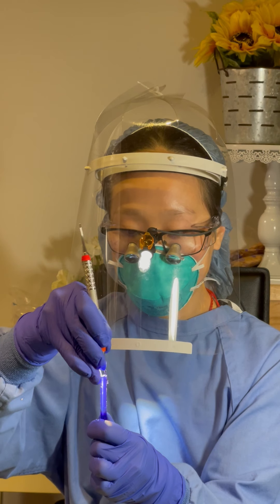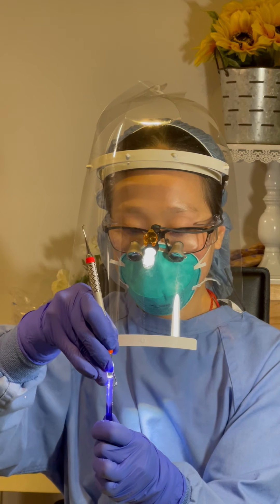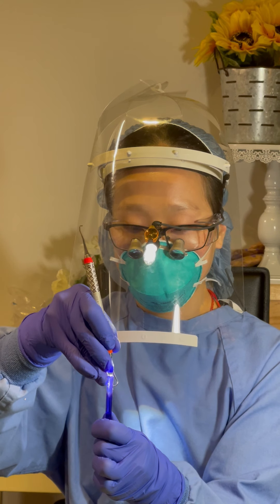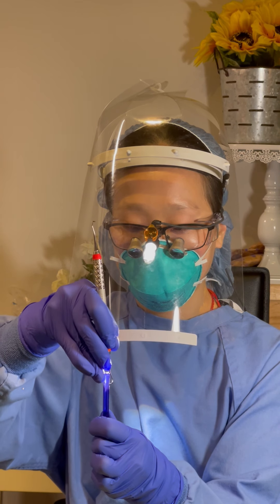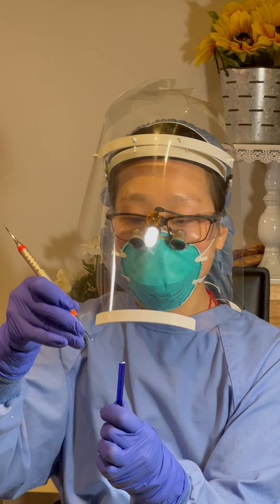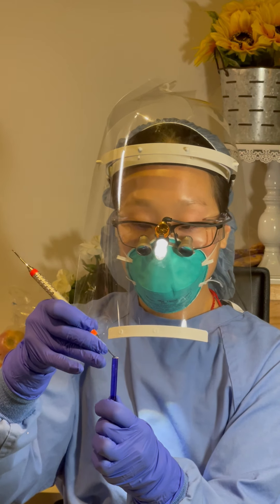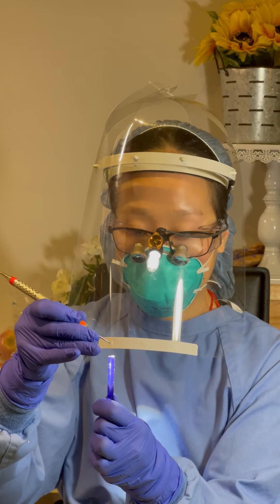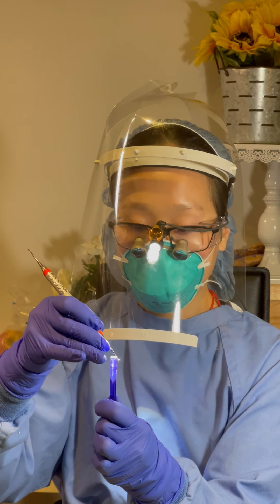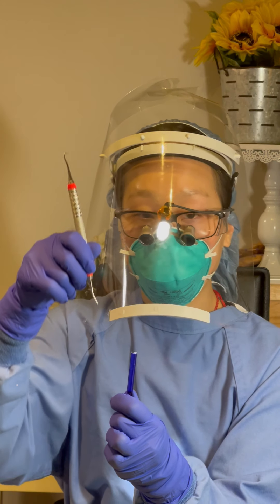Starting from the heel — pressure, release; pressure, release — mid third, tip third. The sharp instrument will bite onto the stick and when released will produce a metallic sound. However, the dull area will glide along the stick. So now I have already tested the two blades of the same end.